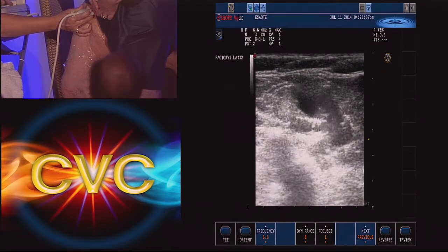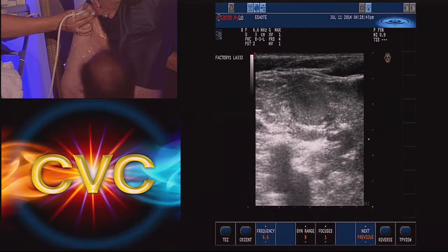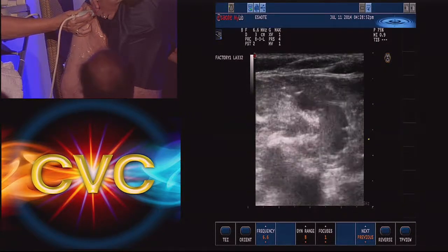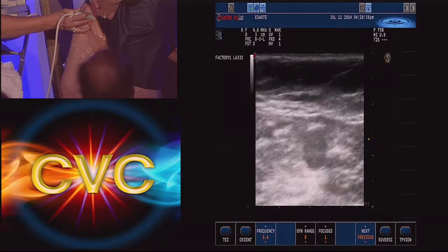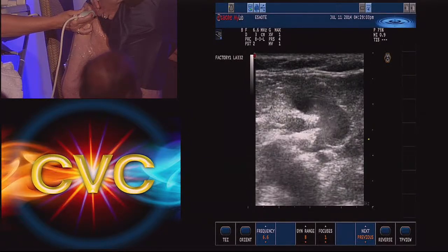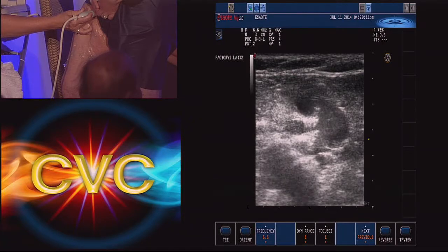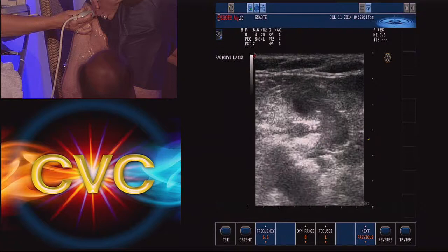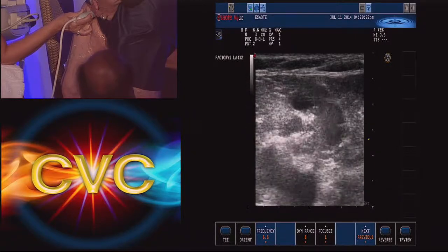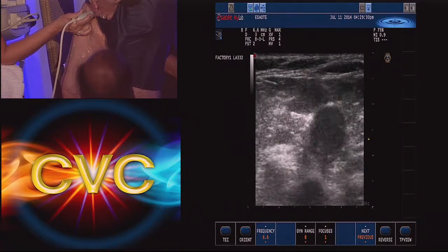True, but you've got to be careful. Yes, you can treat just that short segment, but this is a really short segment, and you want to make sure you're not in the common femoral vein, because once you cause a DVT, you've condemned the patient to anticoagulation, a possible PE, and a lot of other problems. Hers is very unusual, and you see it's quite deep. This is something you almost treat like a perforator, and what I would do there is ablate that portion, and at the same time, foam everything else on the side with 1/4 Sotradecol. That means I took 3% Sotradecol, diluted it to 1/4, so 0.75%, which is pretty concentrated. Let it sit in that whole saphenous all the way down, and then give them very good compression.